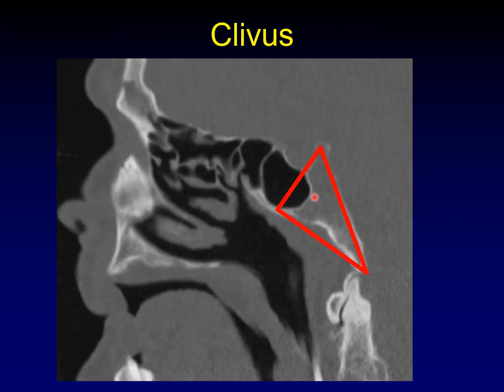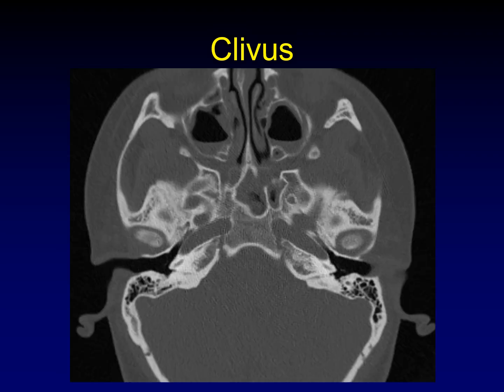Here's that picture of the clivus again. It's a triangular bone, at least on sagittal projection, that forms the central skull base in the midline. On a little image it perhaps looks a bit more rectangular. If you look carefully, you can still see the fusing plane in the midclivus in this young patient. In children, this is an obvious gap between the upper and lower clivus, and that's totally normal. This one's sort of partially fused — also normal.